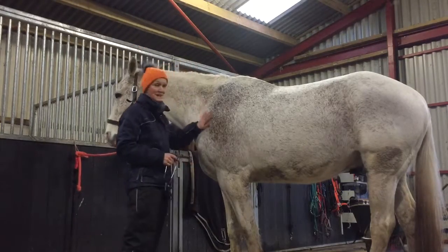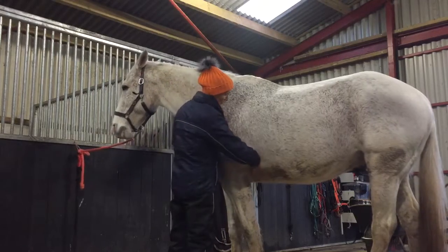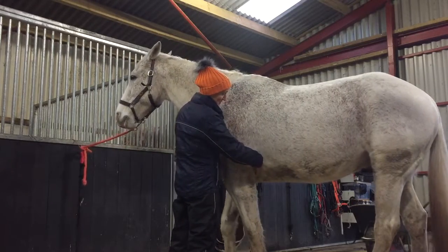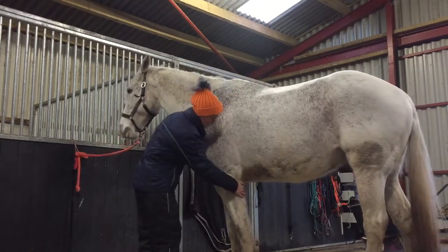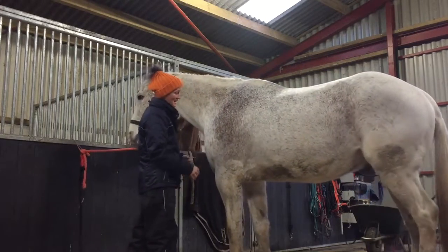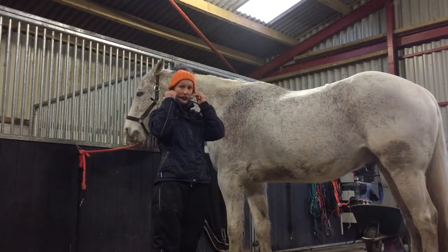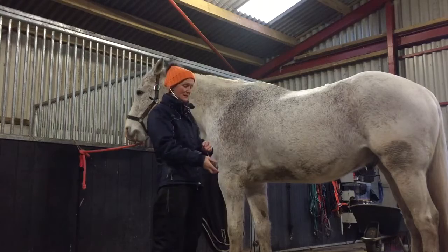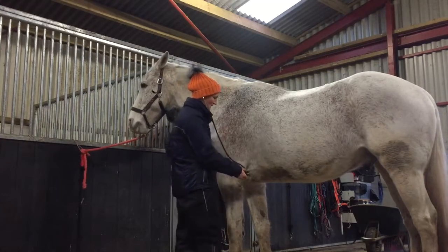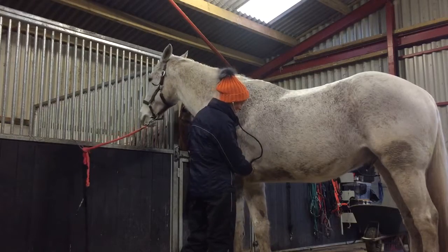It's always important to say hello to the horse when you walk up to them. The heart of a horse is quite far forward on the left side of their chest, so we need him to put his leg forward and down. Then we place our stethoscope in our ears and place it on the heart, making sure we have good contact.